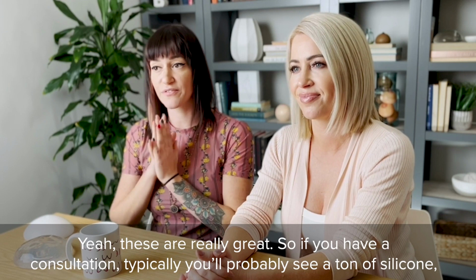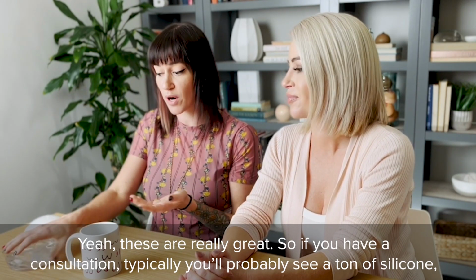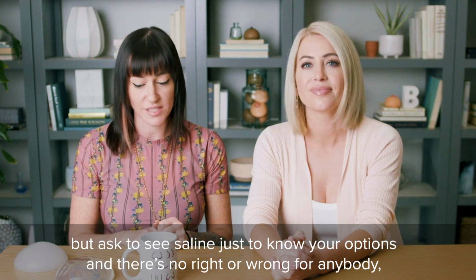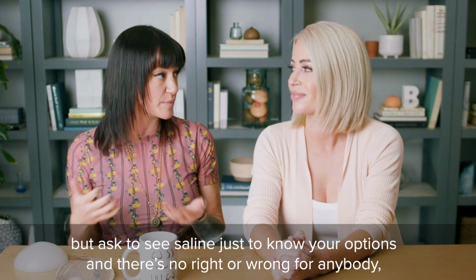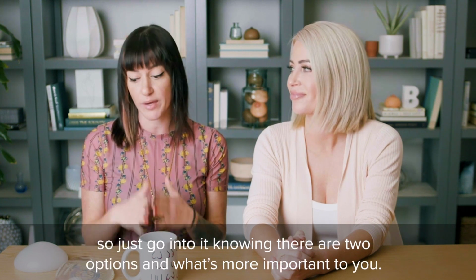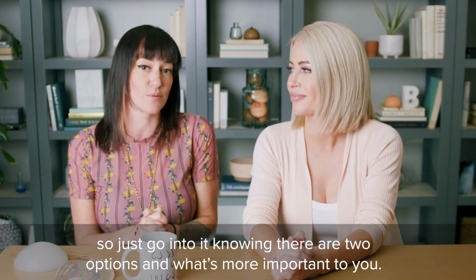If you're at a consultation, typically you'll probably see a ton of silicone, but ask to see a saline just to know your options. There's no right or wrong for anybody. It depends on what you want and what your goals are. So just go into it knowing there are two options and what's most important to you.